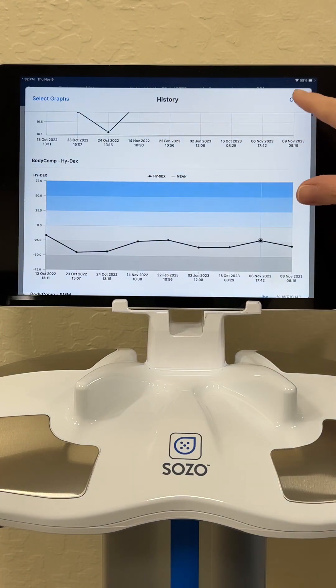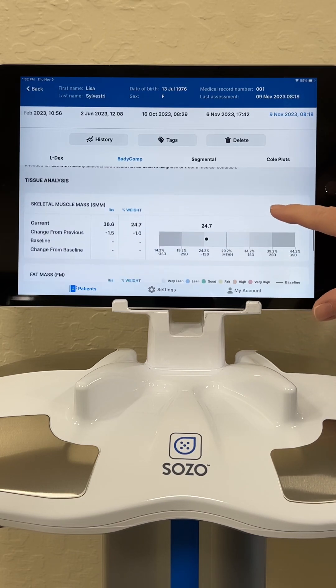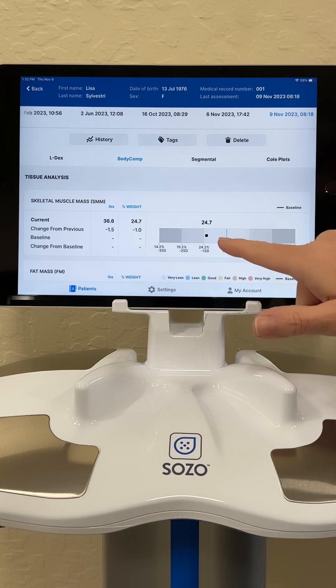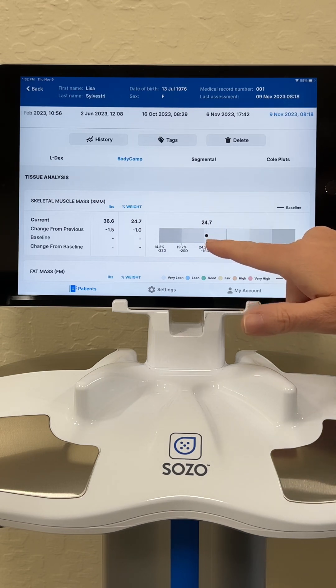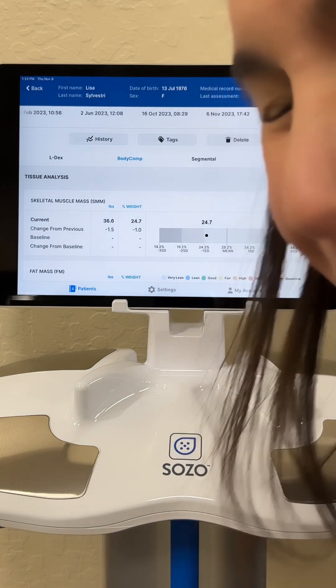Let's go back to looking at the measures right now and look at my tissue analysis. When we're looking at tissue analysis, we break down what percentage of our body is skeletal muscle mass and what percentage is fat mass. You can see that I've fallen off the wagon — my skeletal muscle mass is relatively low. I have not been working out, I have not been doing what I preach, and I'm paying for it. And if I scrolled even further, you would see that my fat mass has gone way up — but I'm not going to show you that.